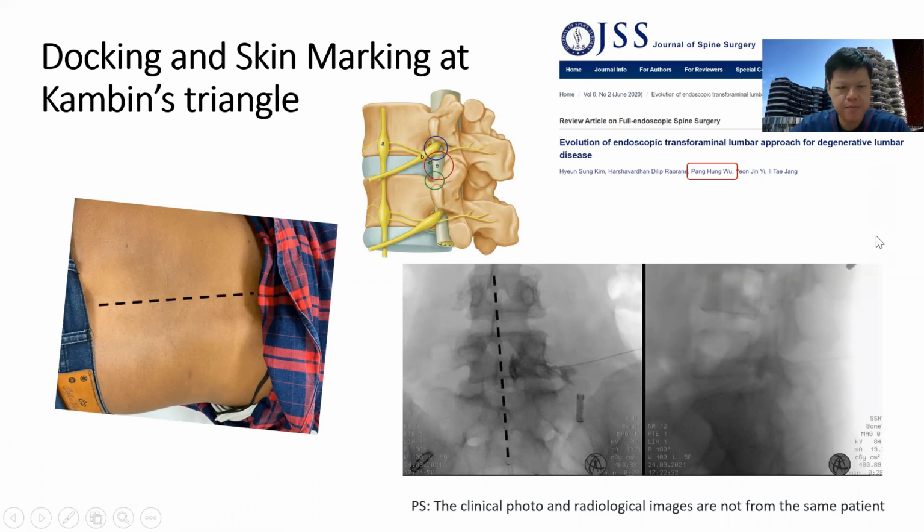First, we mark the midline of the patient, and then we mark the disc space and the superior end plate of S1. Then we mark the approach from the AP view. I tend to do it in a slightly cephalocaudal and lateral to medial direction, as seen here. We mark the iliac crest. You can do that under fluoroscopy or under manual palpation. I tend to do it with fluoroscopy.